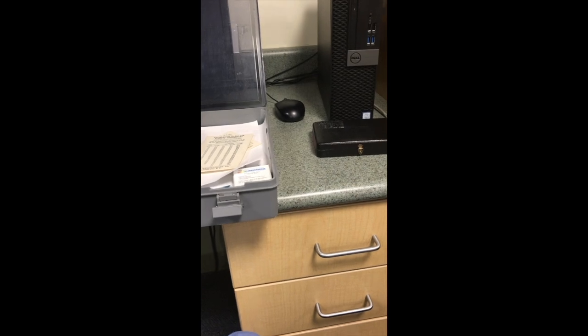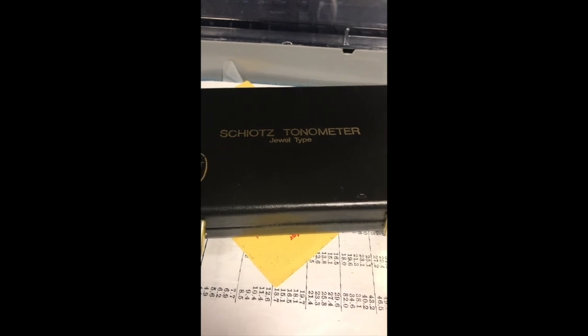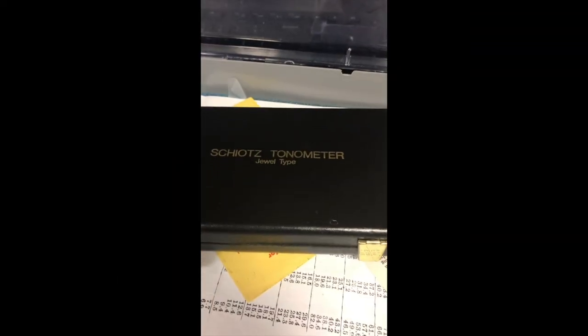This is an instructional video for how to use the Schiotz tonometer, which is an old-school device for measuring intraocular pressure. It comes in this large case. Inside there are two smaller black cases, one here and then one there.